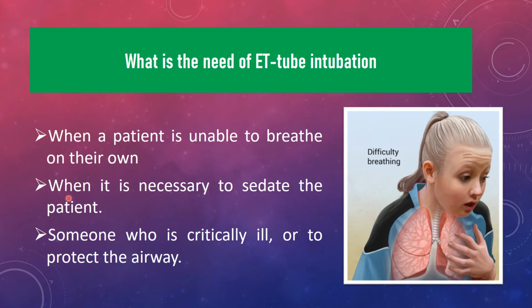And when it is necessary to sedate the patient, in that condition we need to intubate the patient so that we can provide mechanical ventilation. If the patient is critically ill, in that situation we have to protect the airway and provide external respiratory support to the patient.